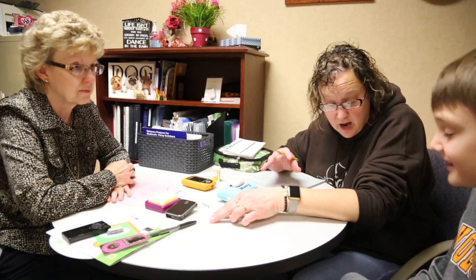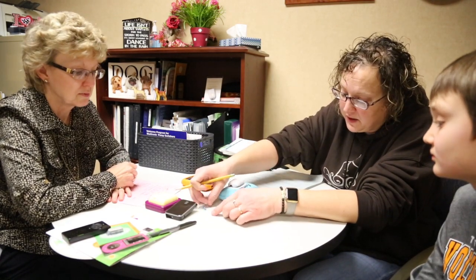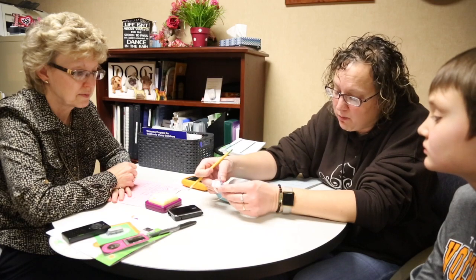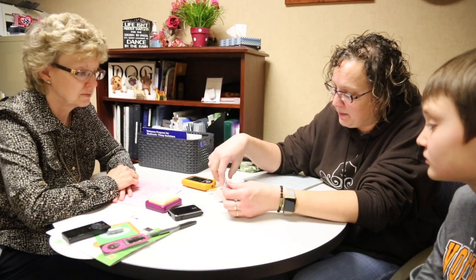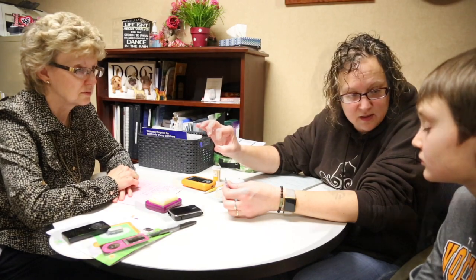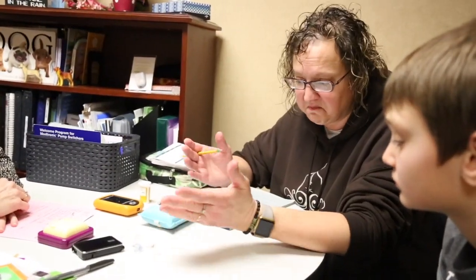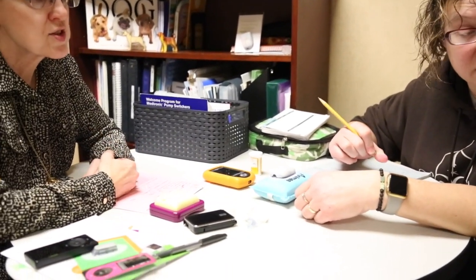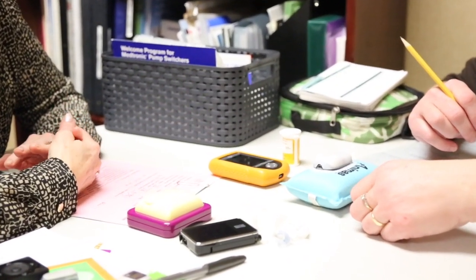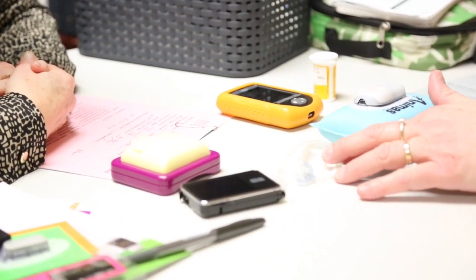Are you sure? Yeah. I don't think this is going to be a big deal. It's got a little thing that sticks in here. It's actually smaller than this. The thing that is connected to the Omnipod is actually a bigger piece. And you're going to have pens available to use as backup, so you can always go back to giving injections. But I think there's no harm in giving it a try.